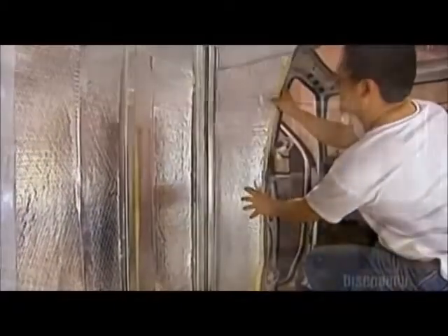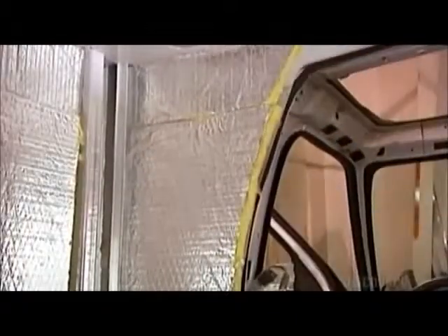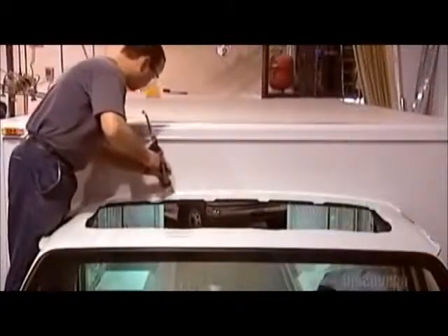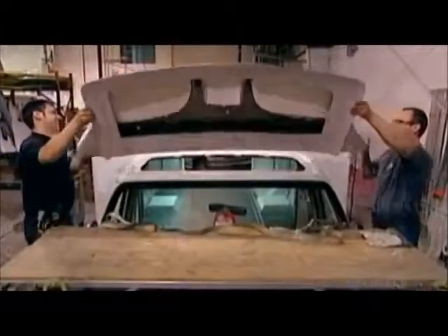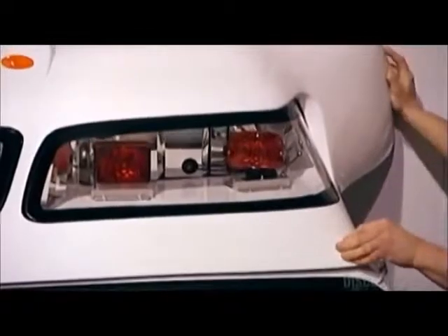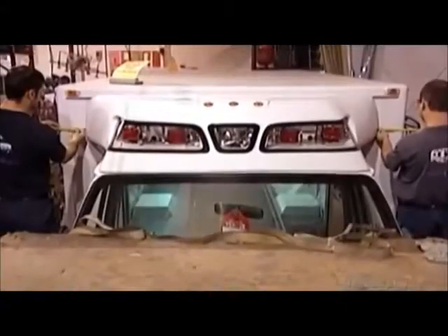Inside, meanwhile, they install fiberglass insulation panels with a fireproof metal surface. This insulation keeps the medical area warm in the winter and cool in the summer. Workers affix the raised roof with adhesive caulking. The roof has integrated lights. Protruding lights would ruin the streamline. Workers measure carefully to ensure they center the roof perfectly.